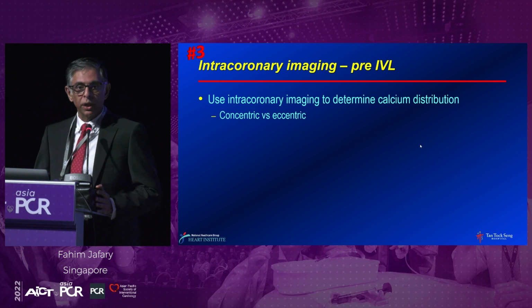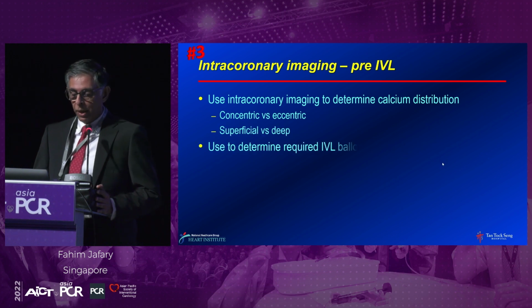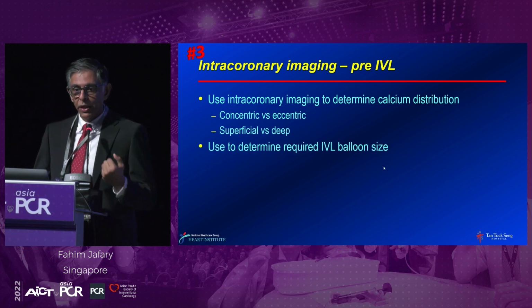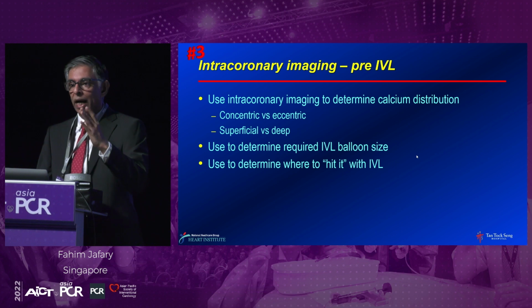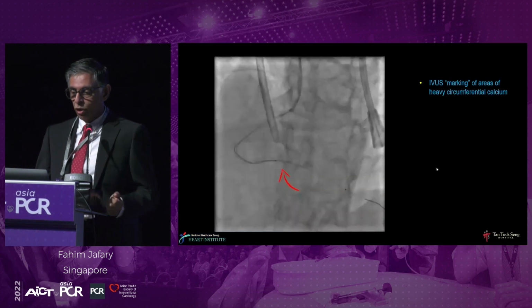The third guiding principle for IVL is imaging before, and when you image before, you determine the calcium distribution. Is it concentric or eccentric? Is it superficial or deep? And it helps you determine the balloon size that you may use for IVL. And it also helps you determine where you're going to hit it with the IVL and where you're going to not hit it. And that's sort of illustrated here.